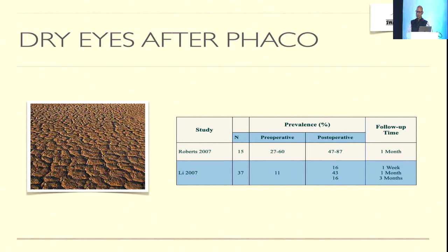The key here is to identify preoperatively that the patient is at risk for dry eye postoperatively. Most of these patients have a low TBUT, which we wouldn't have realized. So when you're doing the slit lamp examination, put a drop of fluorescein and see the first random dry spot. If your TBUT is anywhere less than 10 seconds, then that's a cause for concern, and you must address it with warm compresses, etc.